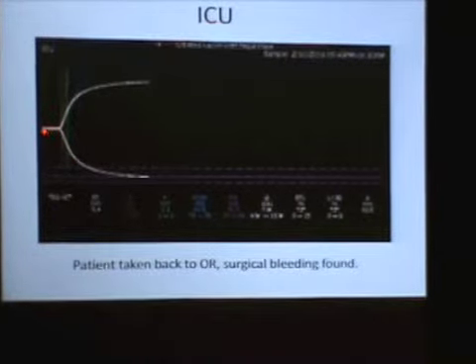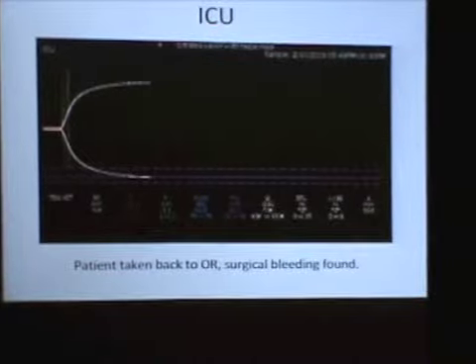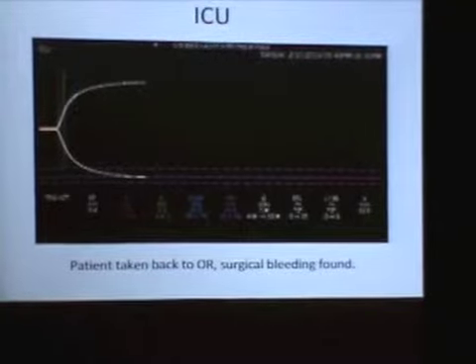So if you're seeing a long R and a shallow slope and a narrow MA, you have coagulopathy. If you're seeing a normal curve, I call the surgeon. Surgical, or DDAVP or surgical.